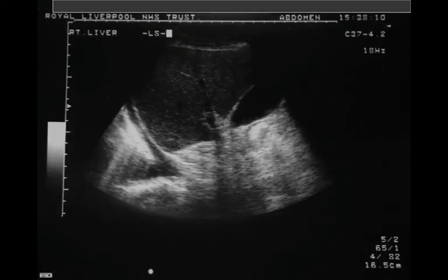And as the patient takes a breath in, the lung comes down into that pleural effusion, and when the lung actually hits, then you get your bright white reflection with that grey shadowing and acoustic shadowing that you can't interpret anything behind. But again, you can see that some of the ultrasound beam is going through until it hits that fluid, it hits that lung, and you're not getting the same mirror artifact in this image.